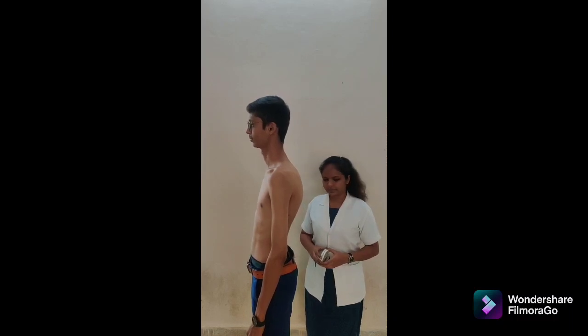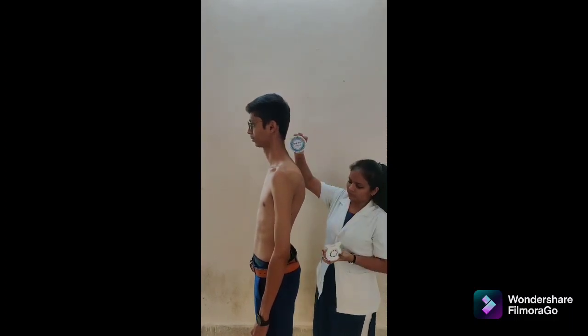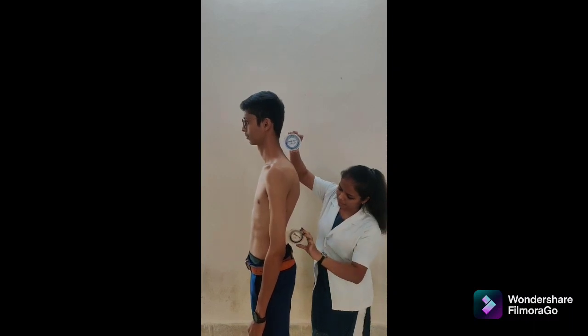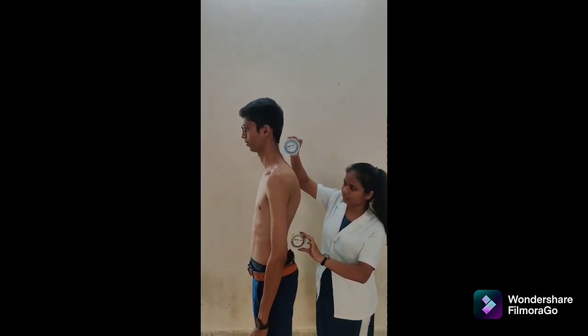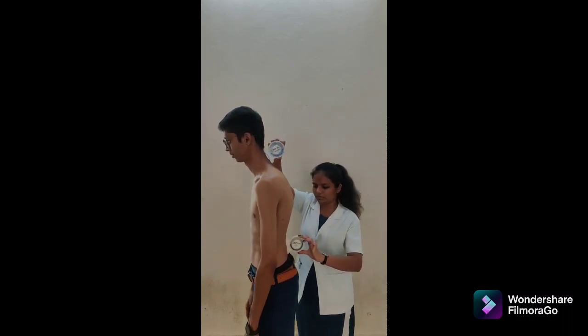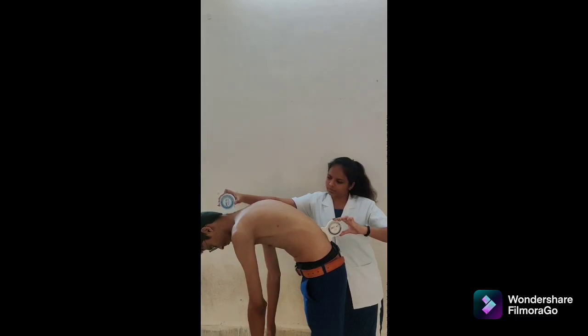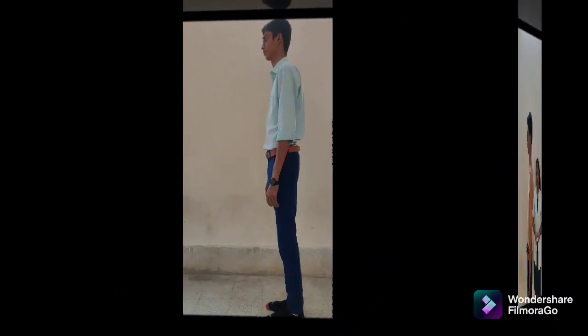Second method for thoracolumbar flexion is double inclinometer. Patient position: standing with knees straight. Inclinometer alignment: place one inclinometer over the spinous process of T1 and the second over S2. Both adjusted to 0 degrees. Instruction: bend forward while keeping both arms relaxed and knees straight. At the end of the motion, record values from both inclinometers. The difference between the two indicates the amount of thoracolumbar flexion. Normal value: 60 degrees.